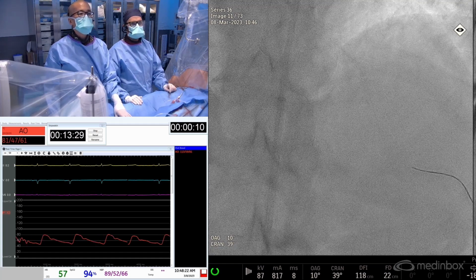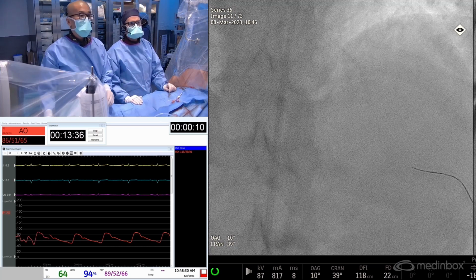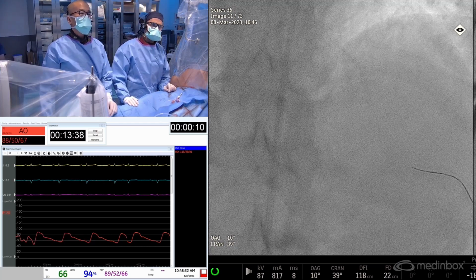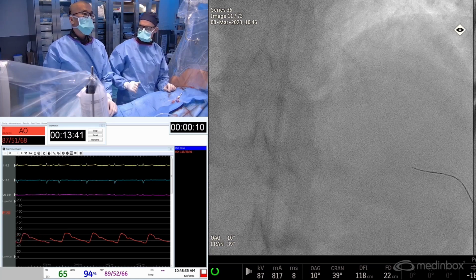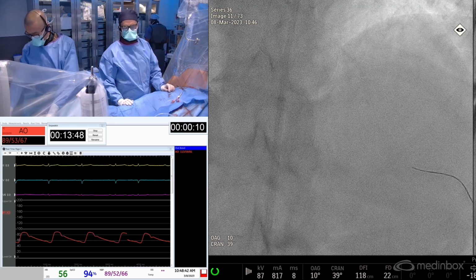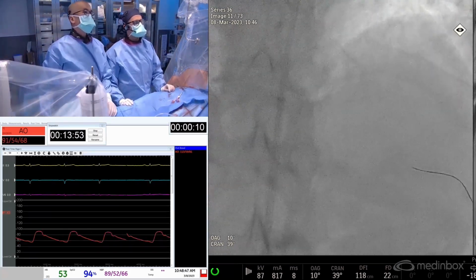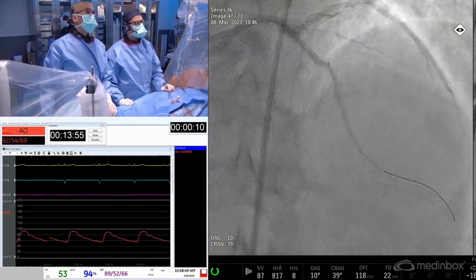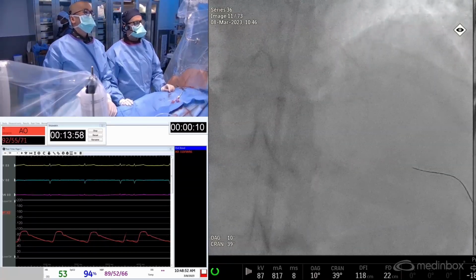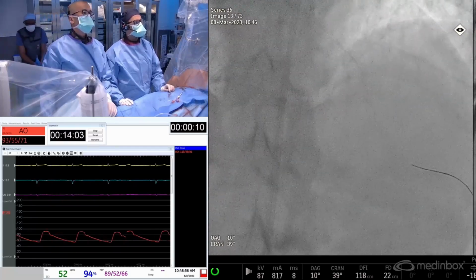Maybe the flush of nitro. We're giving him a little flush of saline, 500, and we're going to add some. Pressure is slowly coming back up. But as you saw in the most recent image, the fluoro save that we just did, there's less spasm compared to the initial. So as we all know, this is the price we all have to pay for a more vasodilated artery.